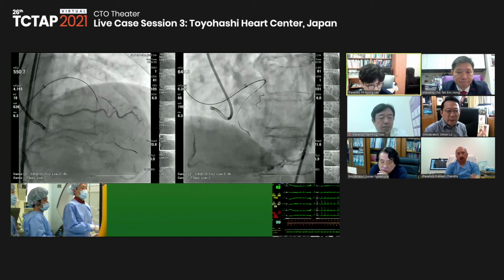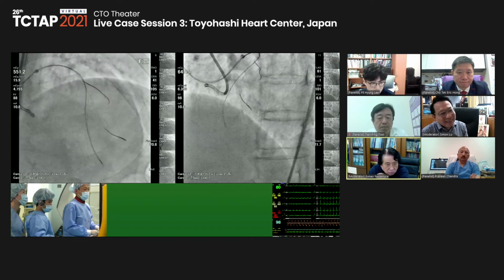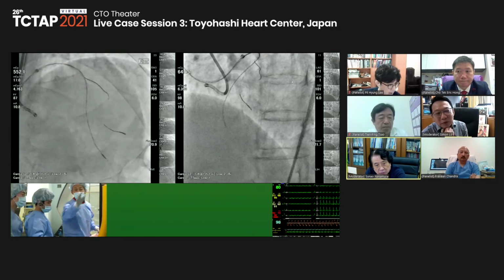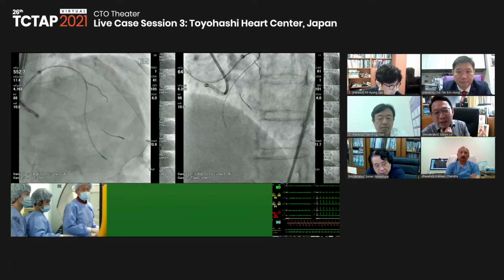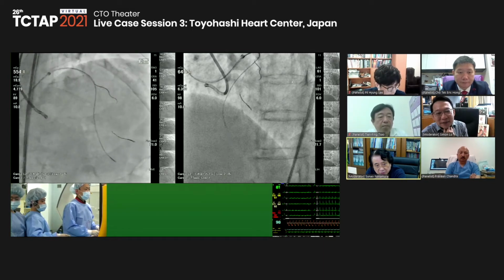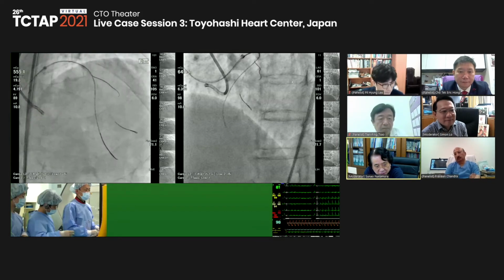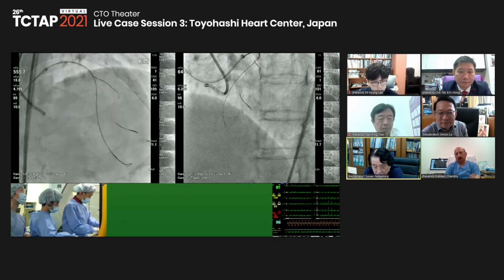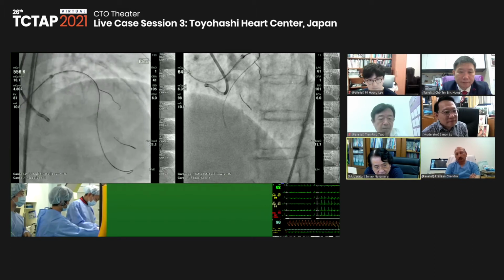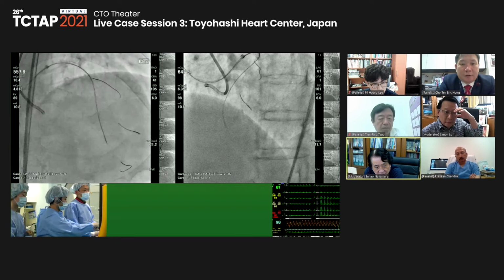I see. Dr. Nakamura, would you also use a single stent strategy for this? Maybe I think my idea is also the same, single stenting preferred, but it actually depends on the size of the vessel after the ballooning of the LAD.